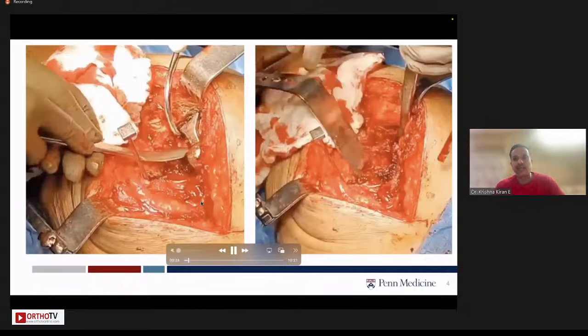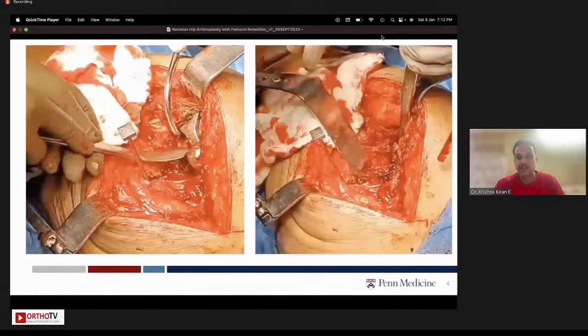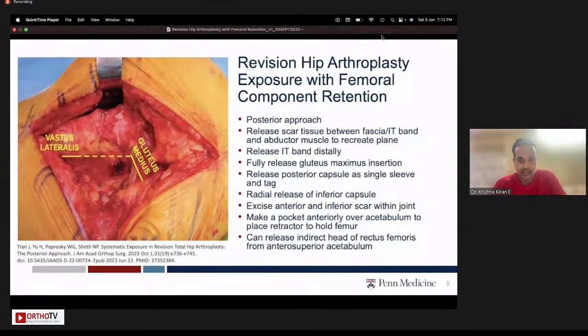The idea in any revision surgery is to get a 360-degree exposure of the acetabulum, which allows us to safely remove well-fixed components, if any. At the same time, we will need to assess and reconstruct the defect so that we have a durable outcome in the short as well as in the long term for the patient. So that is the type of exposure we are looking at. Typically, the surgery is done through a posterior approach, and we need to identify the interval between the gluteus medius and the posterior border of the trochanter, and then create a plane there and not violate the edge of the tissue there. We have to internally rotate the femur, and we believe that the progressive internal rotation of the femur beyond 90 degrees is the key to exposure of the acetabulum.